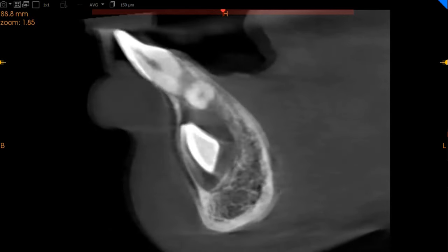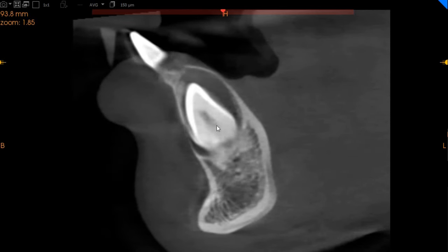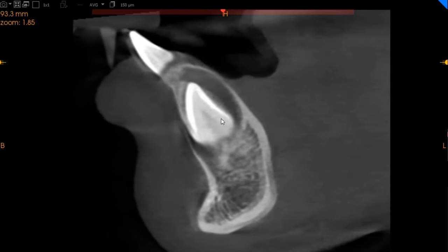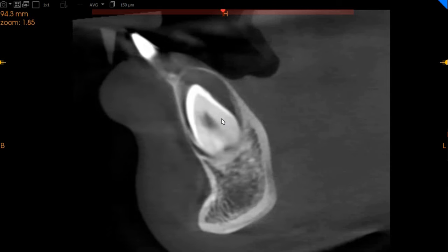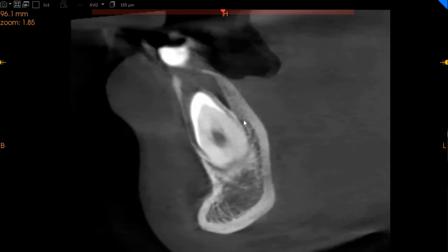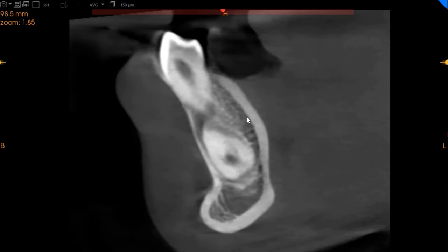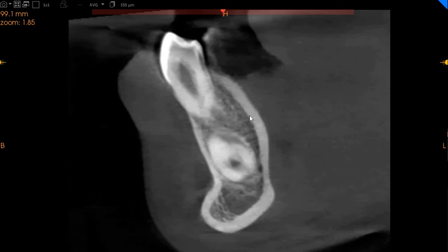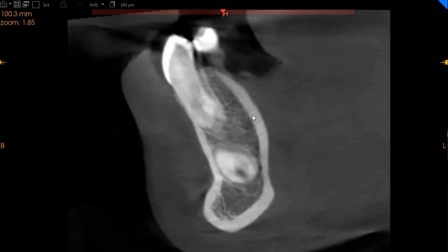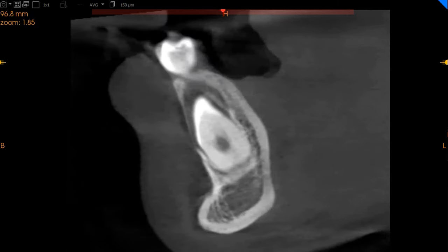Now we move to the left side. This is the left-hand side canine. It is much more closer to the occlusal side, but as we move posteriorly, you can see that it has a closed apex and this is the positioning of the tooth.